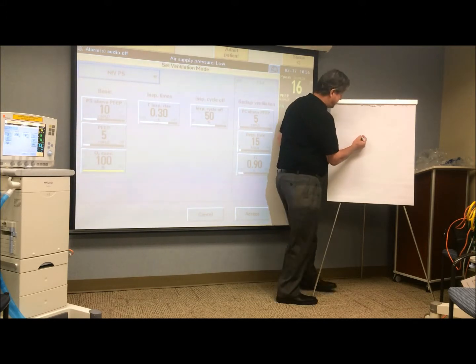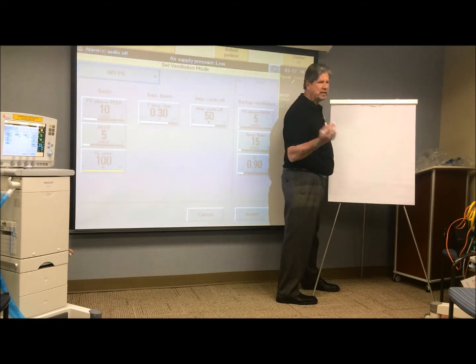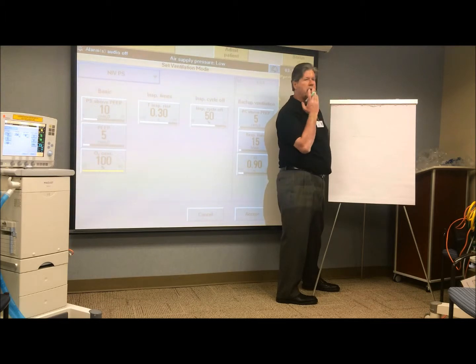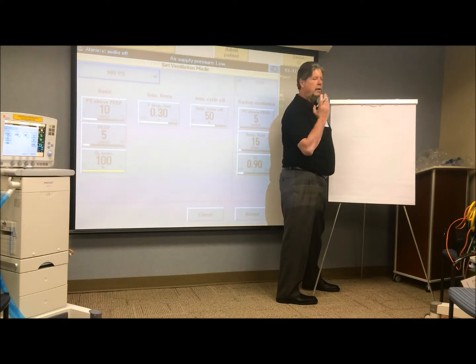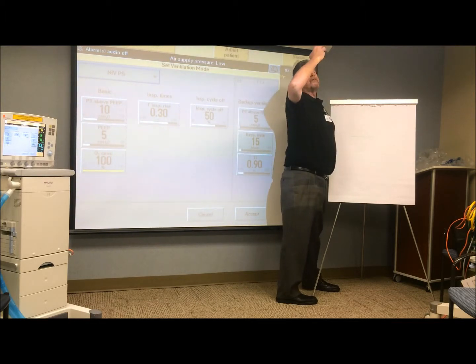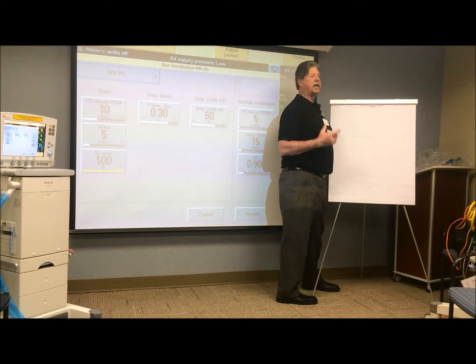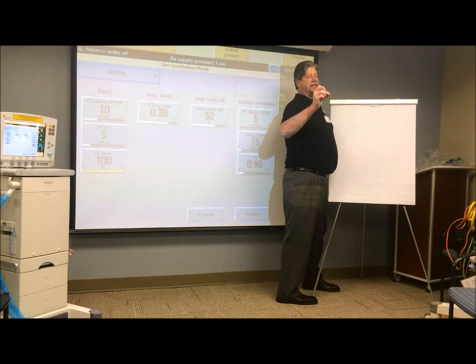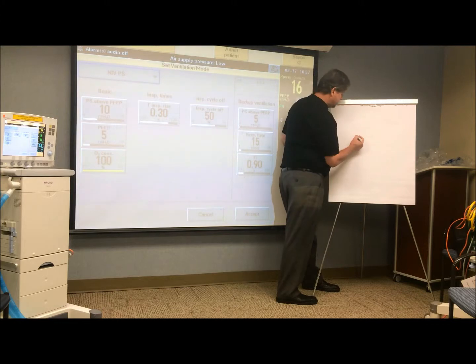Well, the way that works, and this is essentially the same in all ventilators, is that when we breathe, we start at zero flow. We breathe into some peak flow as we breathe in, and as our lungs fill, flow slows down, and just for an instant, before we go to exhalation, our flow is at zero flow, and then we exhale again. So it looks like that, right?